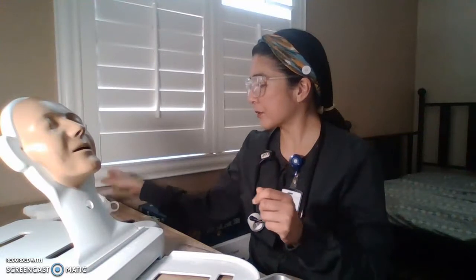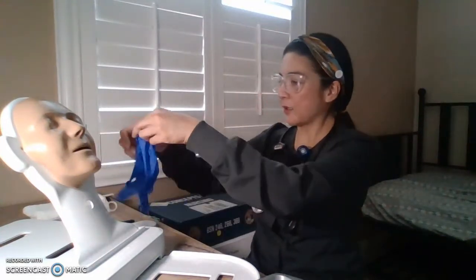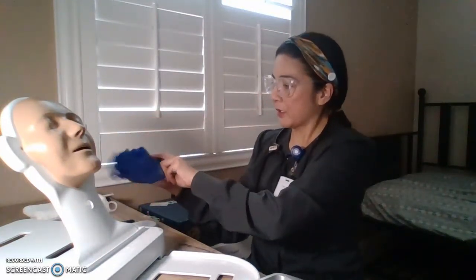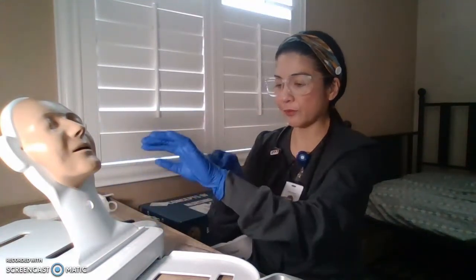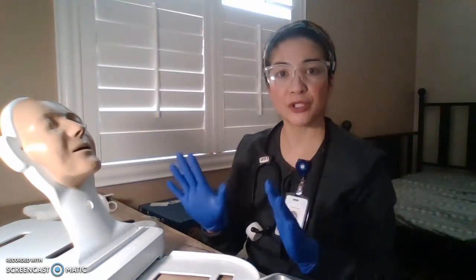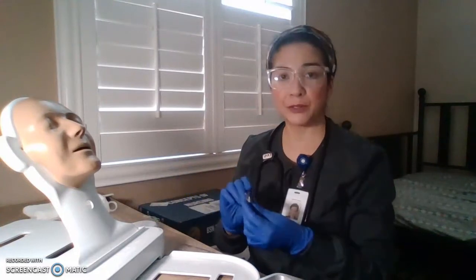So, what we're going to do is we're going to start hand hygiene first. Again, let's put on our gloves. So now what are we first going to do? We are now going to confirm which nostril we're going to insert the tube in, okay? So how do we do that?